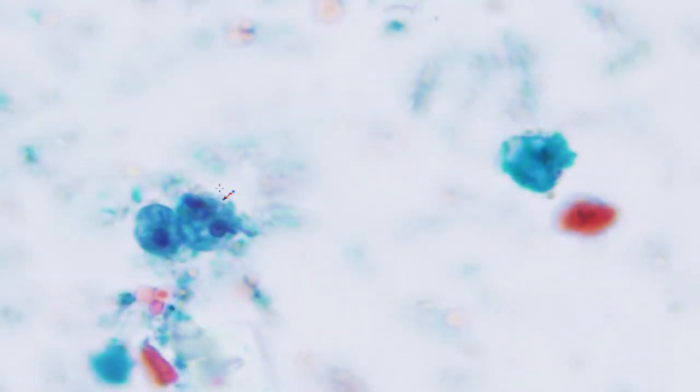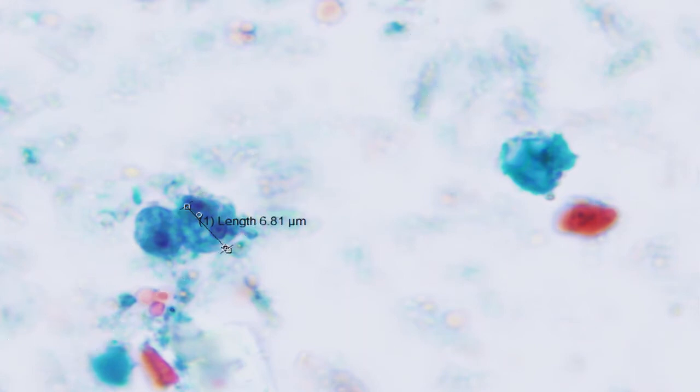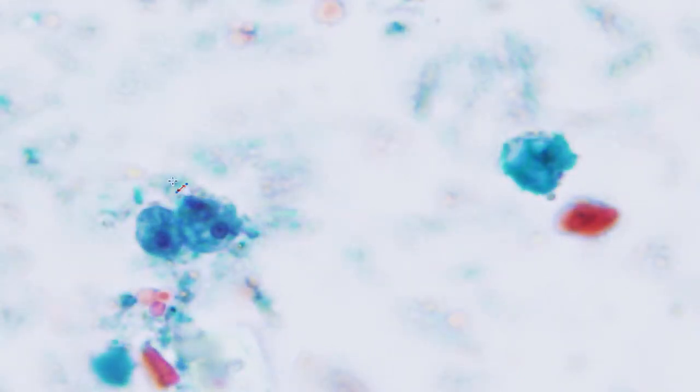Just trying to find, here's a few more here. We'll just move this one more into focus. And you can see there's that lovely histolytica type nucleus, central karyosome, even peripheral chromatin, quite bubbly vacuolar cytoplasm, but only about 6.5 micrometers in size. So that is not a histolytica, that is an Entamoeba hartmanni, and to one side another Entamoeba hartmanni trophozoite. Remembering trophozoites only ever have one nucleus.